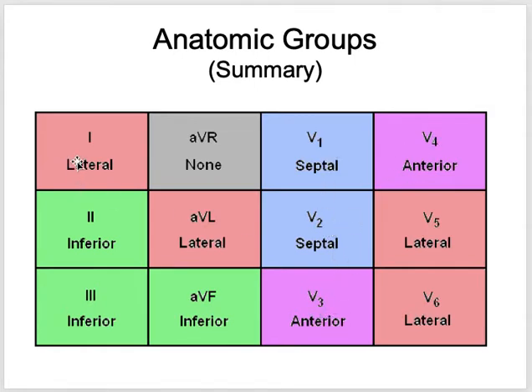If you find changes in these pink leads, it means that there is a lateral myocardial infarction. If you find changes in these leads, it is an inferior myocardial infarction. So simply, this is the point of discussing this: by this we can assess which leads are showing changes.